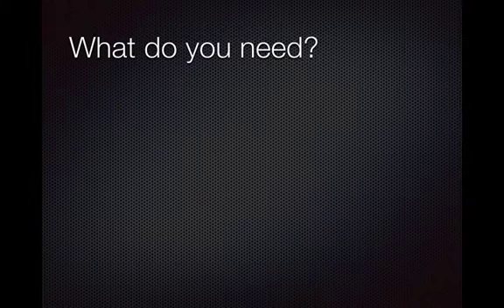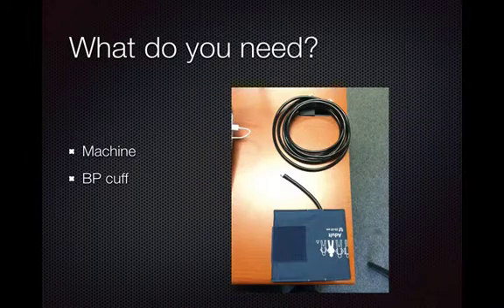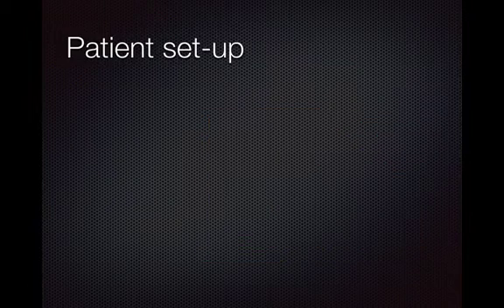So what do you need so far? You need the machine, which is this right here. You need a BP cuff, which is included in the box, and you need a set of leads. Each set of leads comes with 4 electrodes, and they are all oriented right, left, and up and down. Each set of electrodes or leads will actually cost you about $150 to $200, and they're sealed in this black package right here. So unless you have a patient, do not break the seal.